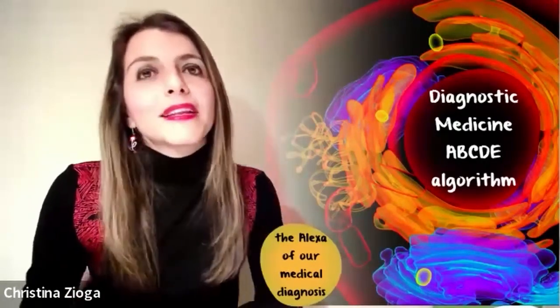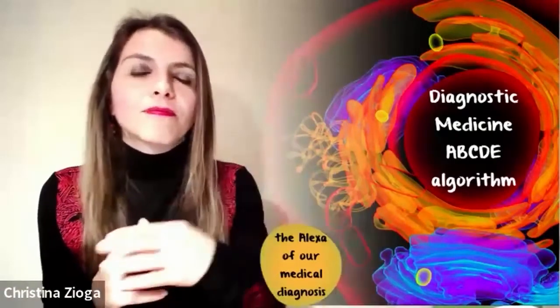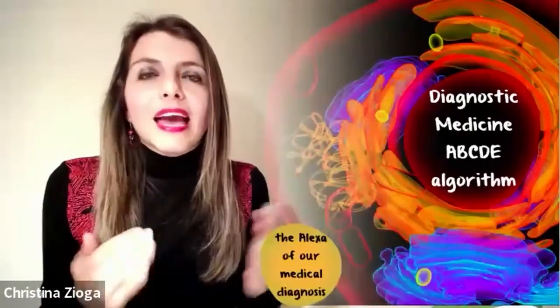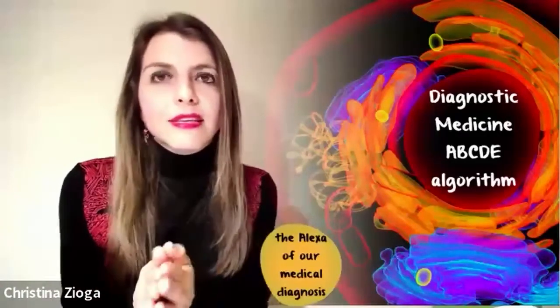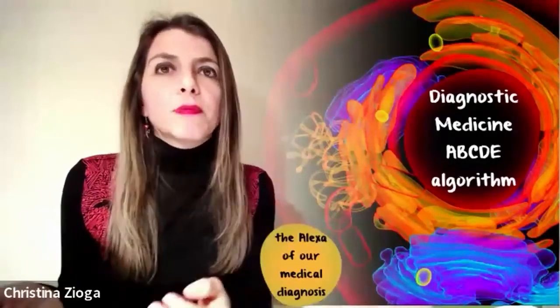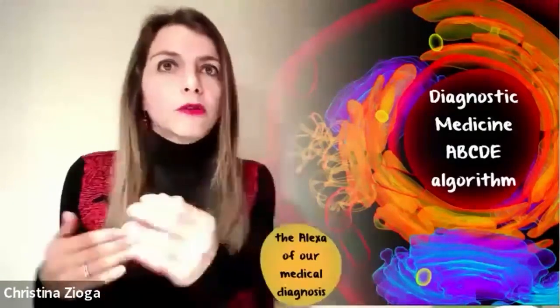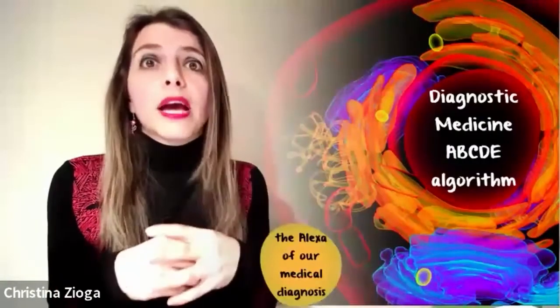Yes, of course. But if we have this ABCDE, when you have a slide and you get it, and then you say, is it correct? A, available information. So what do I know? Especially when we are in this process of making diagnoses every day, we might forget. And then in the morning, some people said that they do the A after the C. I do the morphology and then I check the history, and if it complies, it's okay.